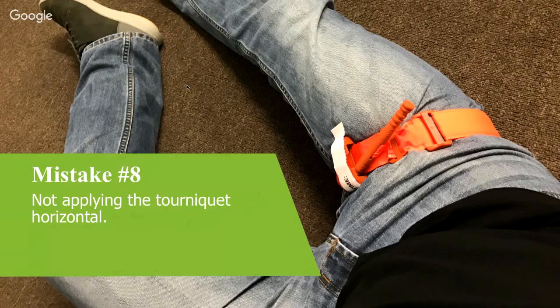So mistake number 8, not applying the tourniquet horizontally. In that image, it demonstrates that the tourniquet is higher on the outside of the leg than on the inside. The natural contours of the upper leg particularly make you want to do that. If you're putting a tourniquet high and tight, you're going to be tempted to do that because you can get the outside of the tourniquet a lot higher.